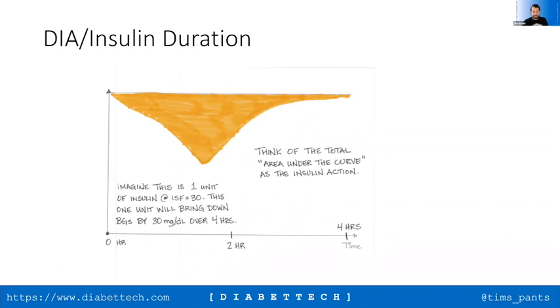So what we're doing here, and as I said, it's a Katie DeSimone image, so it's written in milligrams per deciliter. For those in the UK, divide by 18 to give you your millimole per litre, or roughly 20 will do. If you divide by 20, it's easier and it's pretty much the same. So if you're looking at 30 milligrams per deciliter, you're talking about 1.5 millimole per litre. That's the easy way of doing it.